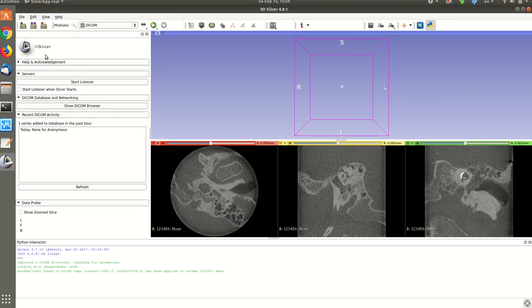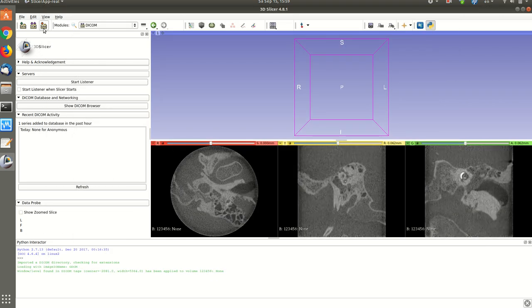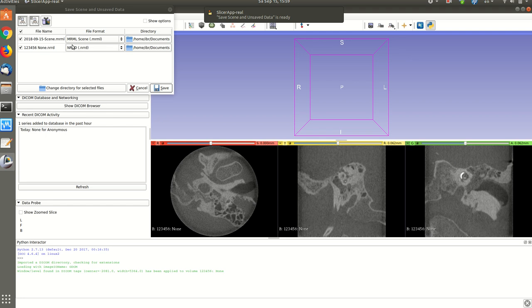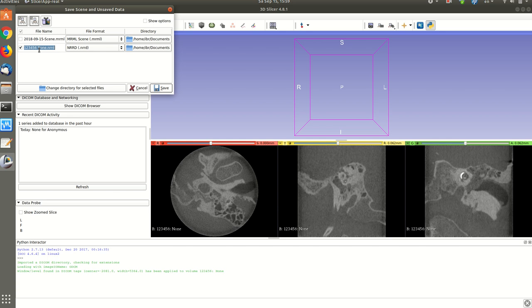I can just click save and decide where I'm gonna save it. I give it a name. It's sometimes very important to have a name without spaces or special characters. So I'll call it for example CVCT cochlea. Then I click save.